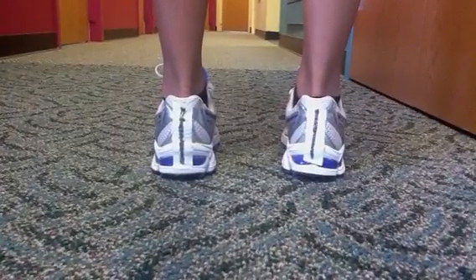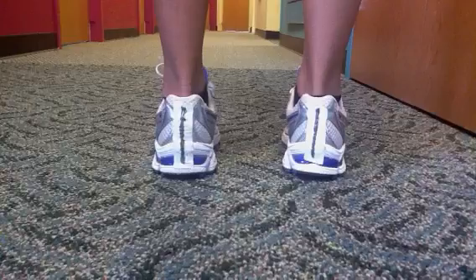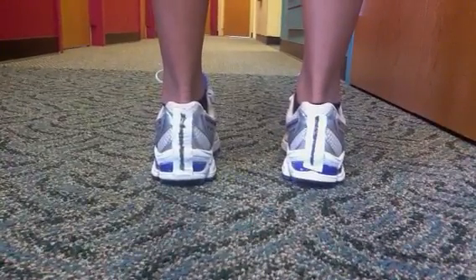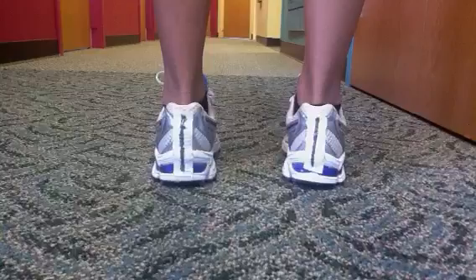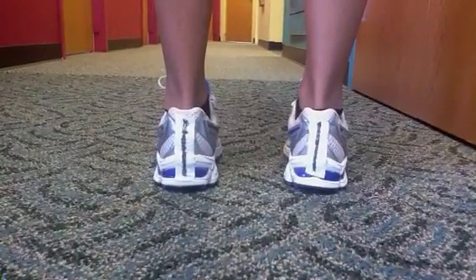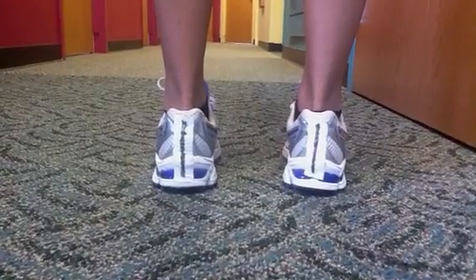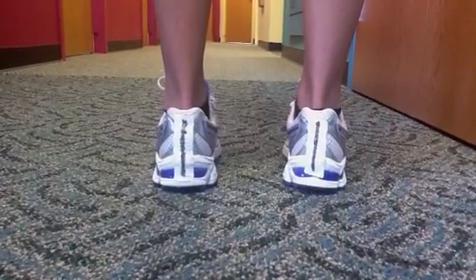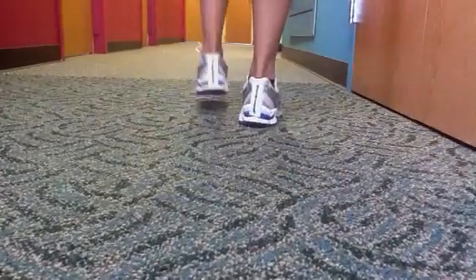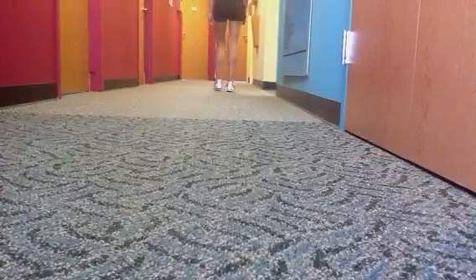Hello, welcome to another post from Dr. Blake's Healing Soul. We had just seen Tiffany walk with her supinated gait, which causes a lot of problems. And we also heard Tiffany, in the last video, discuss the components of the orthotic that she is now wearing. So Tiffany will now walk and show us how the orthotic devices that she has allows more normal motion.